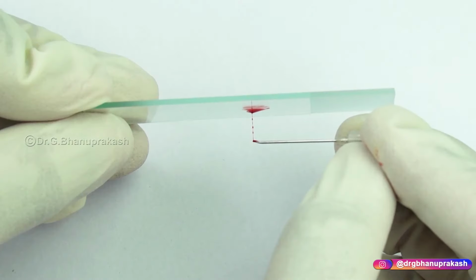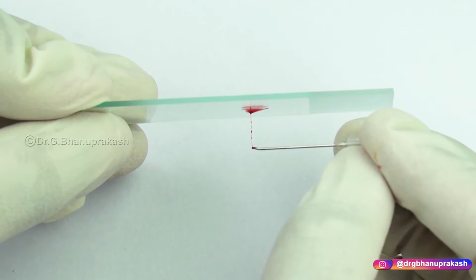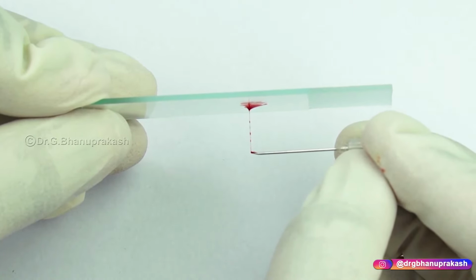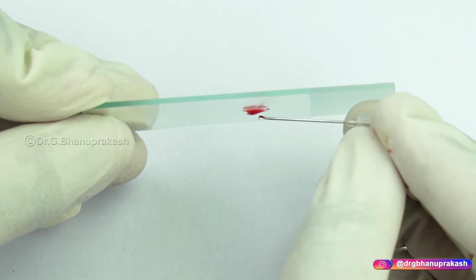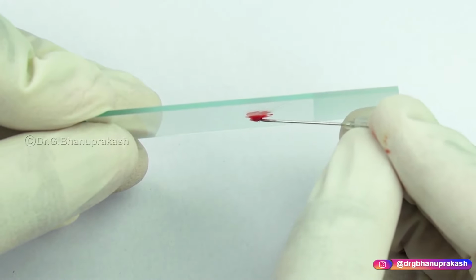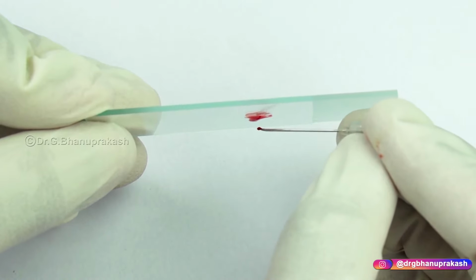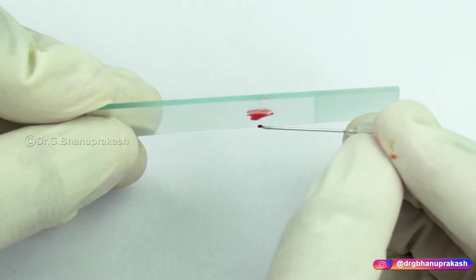Now you see a small string that is coming out of the blood drop. Yeah, this is a small string which you can very clearly see now. Now immediately stop the timer. Now the current timing is 3 minutes 30 seconds. So this is the normal clotting time of the patient.